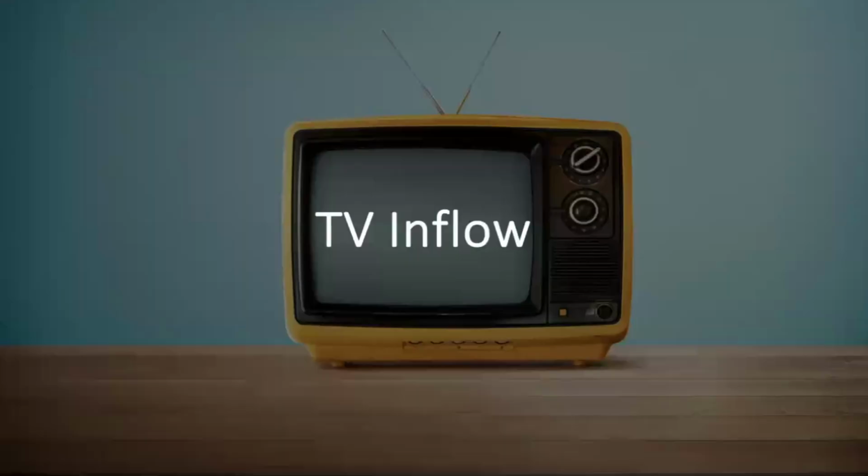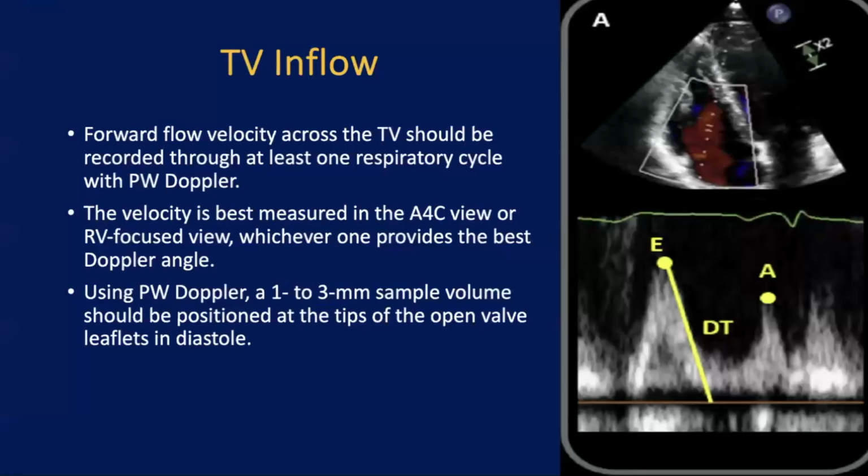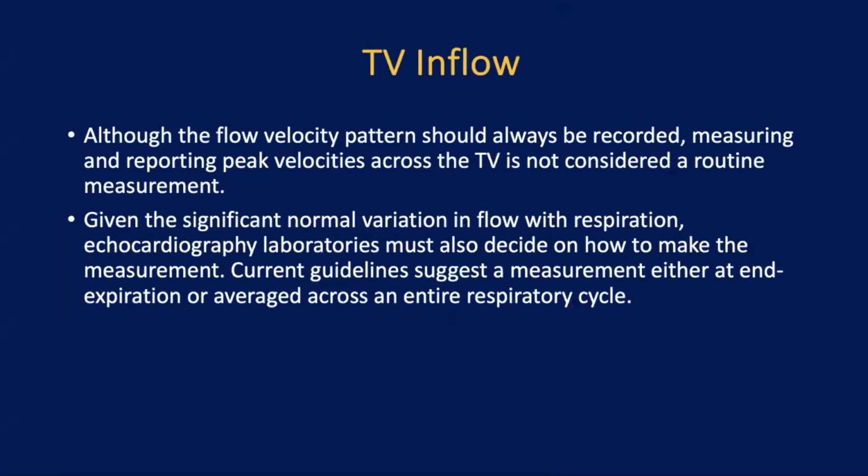It's really amazing. So I was using the computer designer, and when I wrote TV inflow, tricuspid inflow, it gave me this suggestion. So I took the chance for that. And the tricuspid valve, it's the same idea as for the mitral. We will pulse the tips, and you can get the same information. It can be used for a lot of things, but mainly we use it for the variation in the inflow. However, there are some people who will follow the diastolic dysfunction of the RV. We are struggling with the left side, so how about the right side?